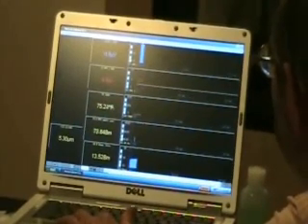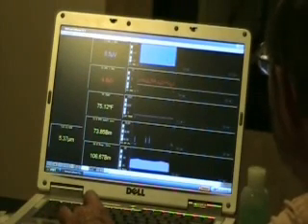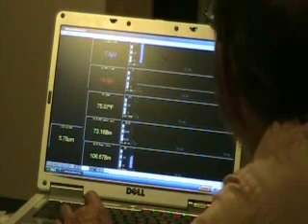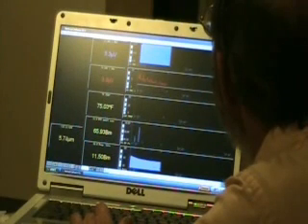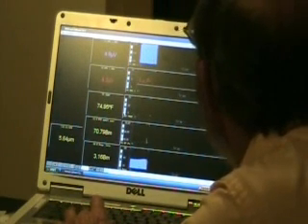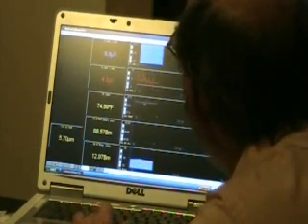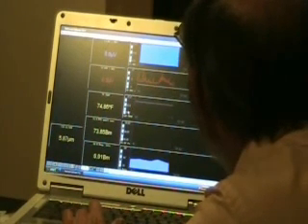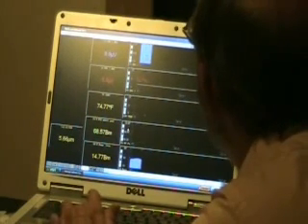And it's saying that you're at about 75 degrees. So what we have to do is adjust the device so that it can pick up in the range that you're at. So now we can see the signal, but we're really not interested in the 50-degree range because we won't be able to see any changes. So let's go ahead and maybe look at a 10-degree range, but we still want to see the signal.